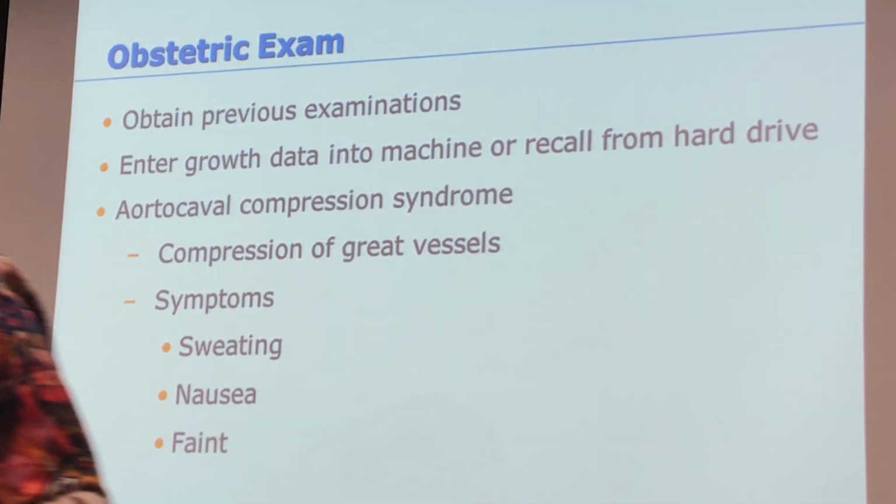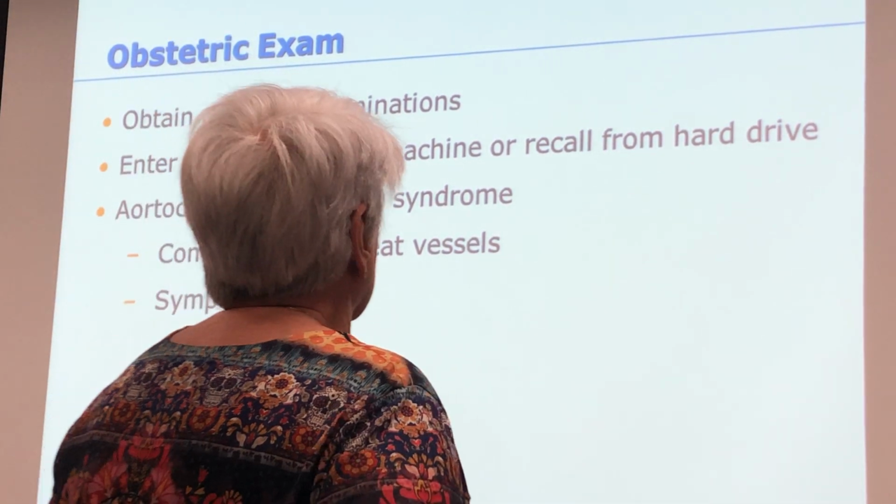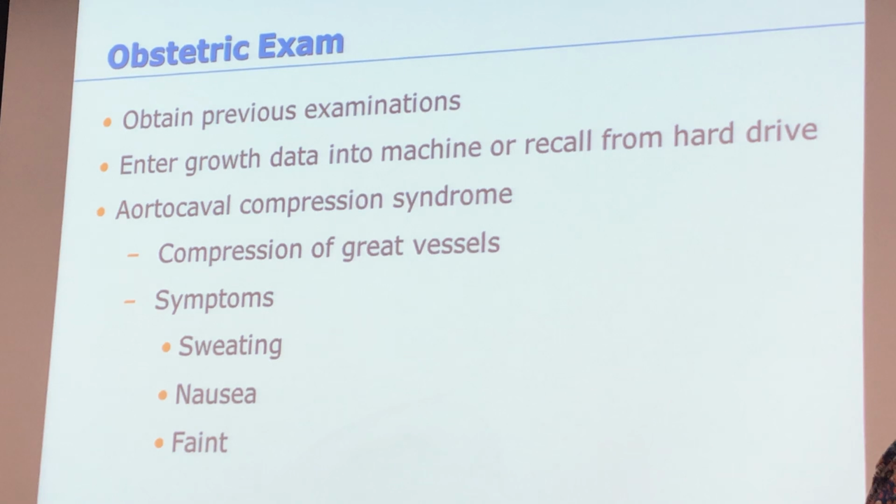Okay? So if you hear your patient, or you watch your patient being uncomfortable, this is what's happening. They can sweat, they get nauseous, some of them can even faint on you if you're not paying attention. Another thing, if you're pressing too hard on the baby, some people have a light touch when they scan, some people have a very hard touch. You can stop the baby's heart just from the compression of the transducer. Be careful. Okay?